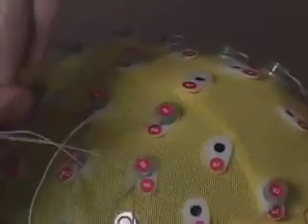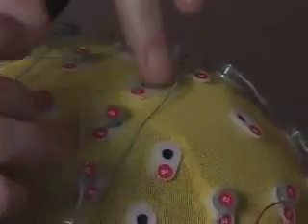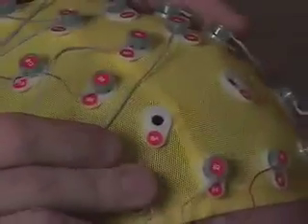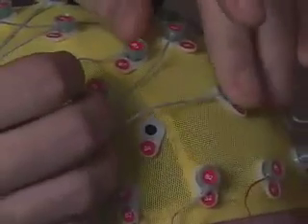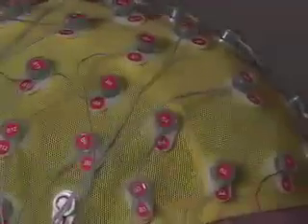They fit in very easily. They just slip right in snugly. It doesn't require much pressure to put them in. And as the electrodes are being placed in the sockets, the tips of the electrodes are being placed into the conductive gel, making the contact between the electrode and the scalp. And there we are. Kate, how are you doing? Fine. Very comfortable. All right.